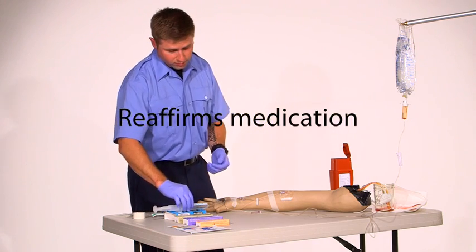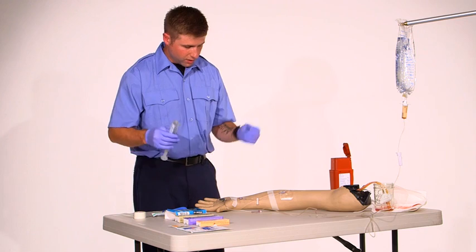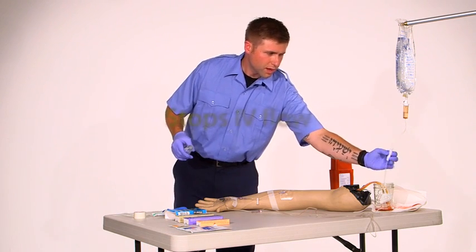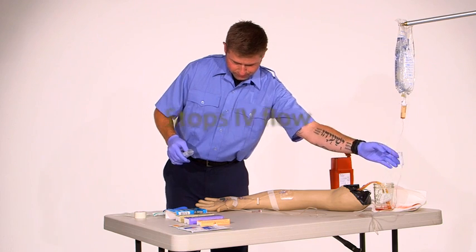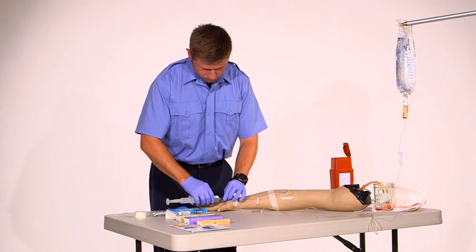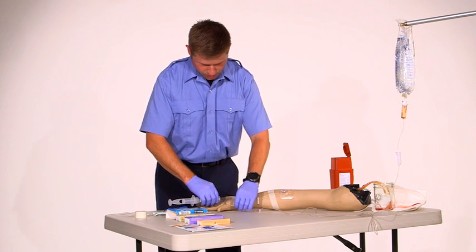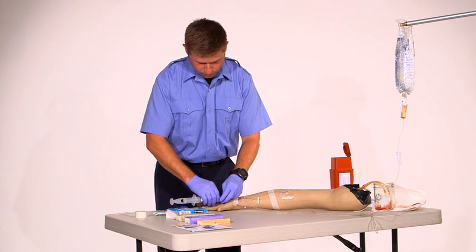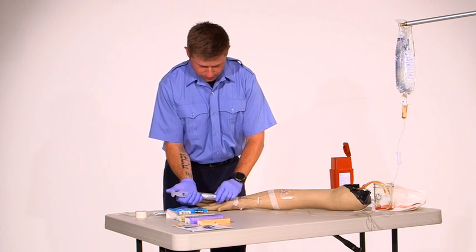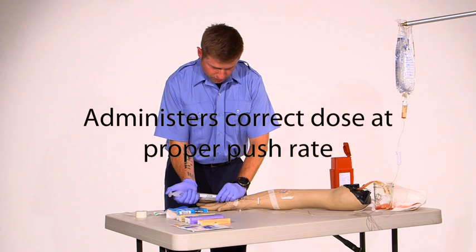Once again, I'm going to affirm that this is 50% dextrose, and I am going to stop the IV line for a moment. I'm going to connect the dextrose to the line. Before I push, I'm going to occlude the line so I don't push any up into the saline bag, and at this time I will slowly push the dextrose.